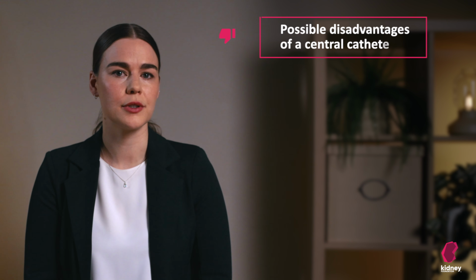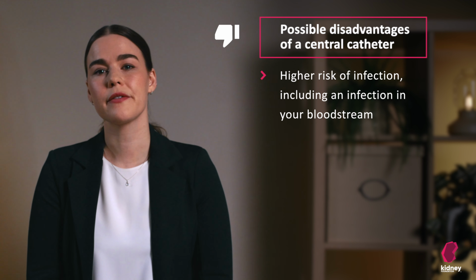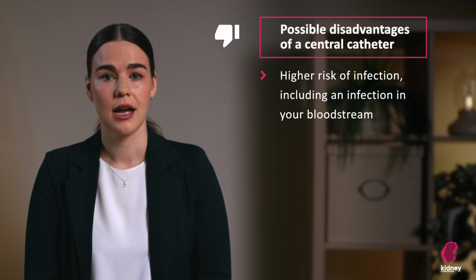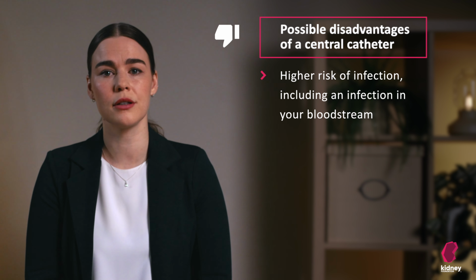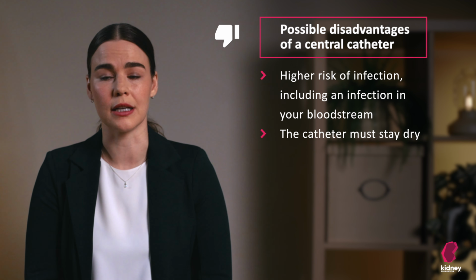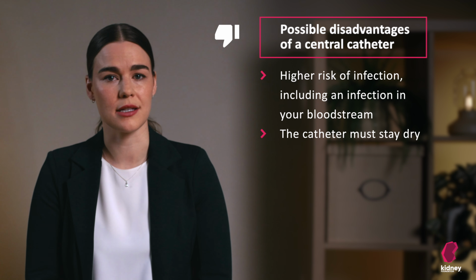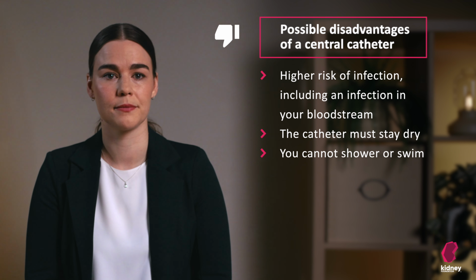Here are some possible disadvantages of a central catheter. There is a higher risk of infection with a central catheter than with a fistula or a graft. As the catheter is in close contact with the blood, infection can spread to the blood and to other areas of the body, such as the heart. This is why the catheter must be kept clean and dry. When the catheter gets wet, it increases the risk of infection. That is why you cannot shower or swim with a central catheter.